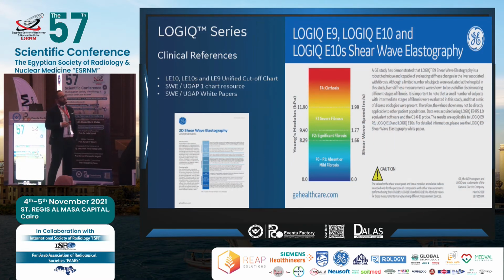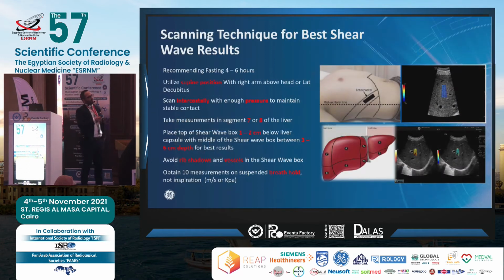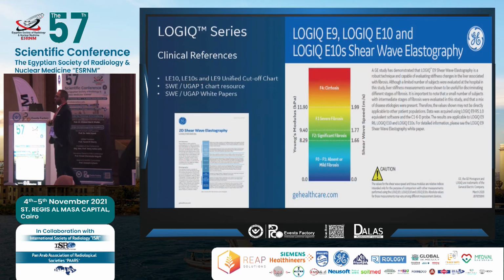So once I have done the shear wave exam and taken my measurements, as you can see in the picture, those circles are where you can take your measurements. The next step is the interpretation. So I've done my exam, accepted, let's interpret.